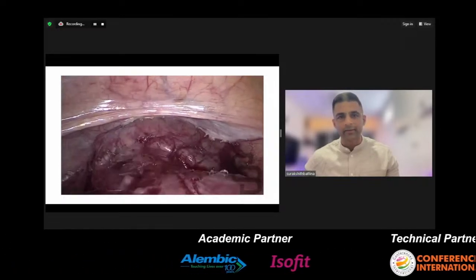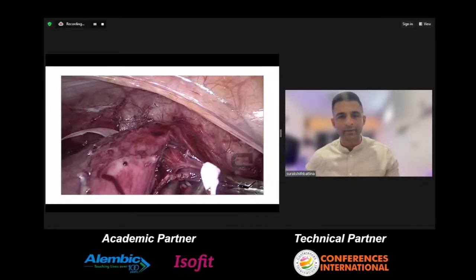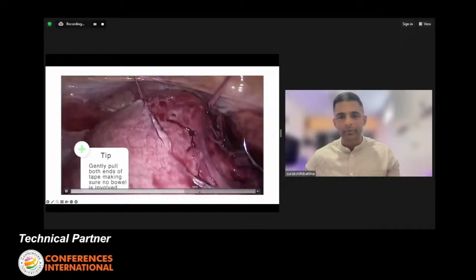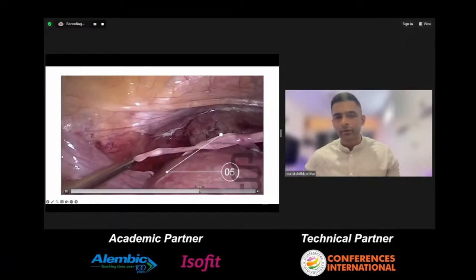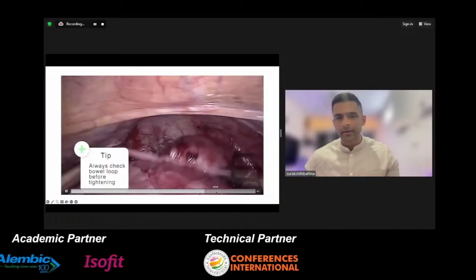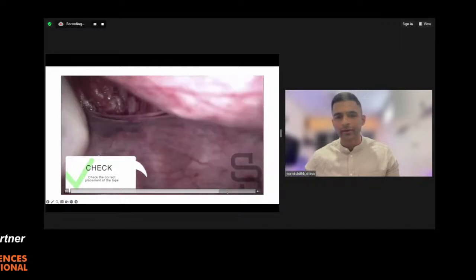And then we do the same thing on the other side. See, again, this window is going to be very useful for you to manipulate the needle. Okay, so again, as I said, gently pull through both the tips, and then we put a total of around 5 knots, and then we check it posteriorly to make sure that there is no bowel loop entangled in there.